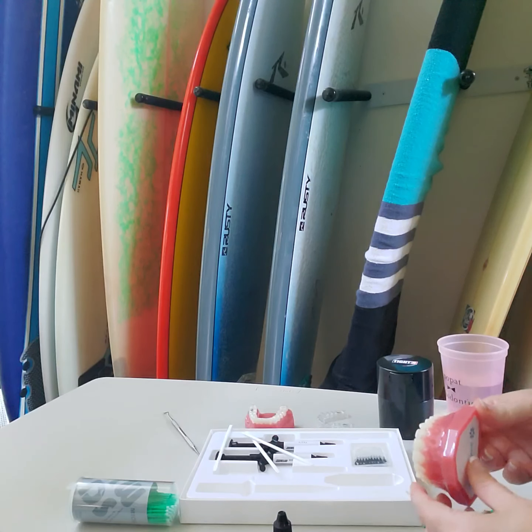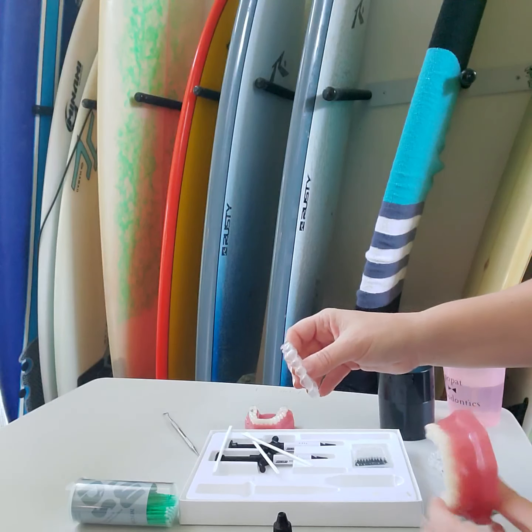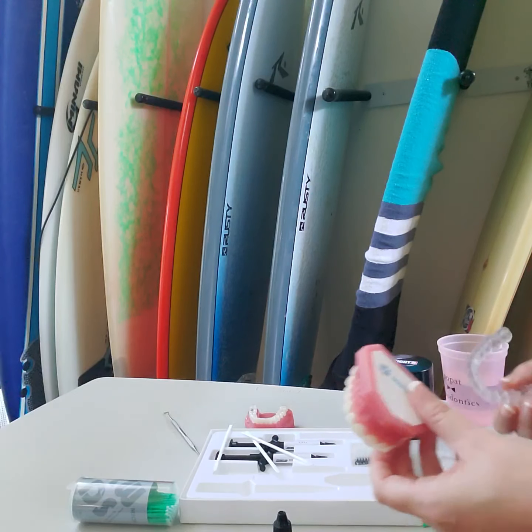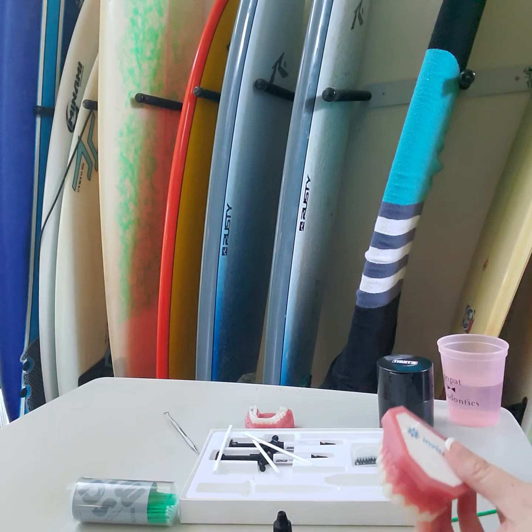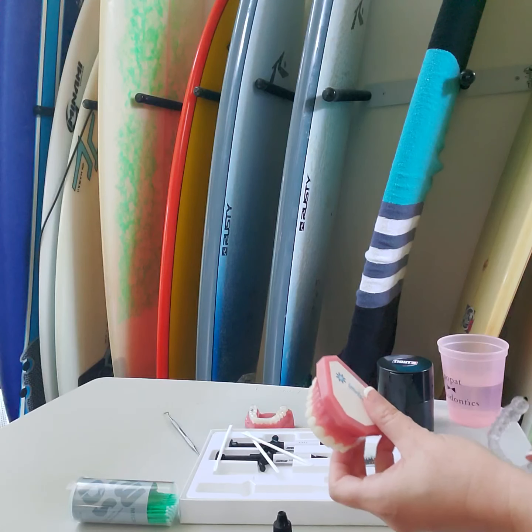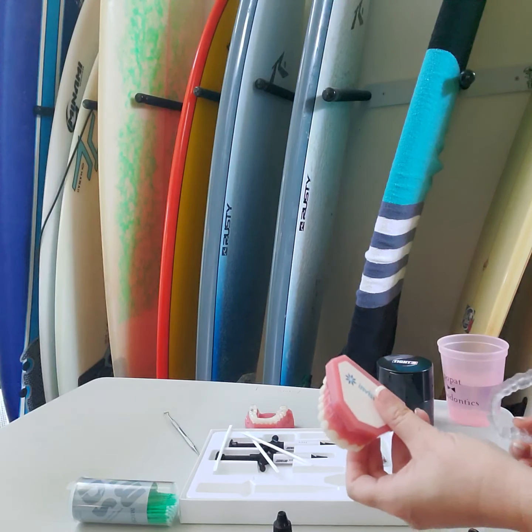Later, when the teeth are moving, save your attachment template because if teeth have moved, you can always section out a tooth and fix it if it comes off. Let the patients know how many attachments they have and tell them to count their attachments because theoretically they can knock one off if they eat something hard like a nut or a candy or something like that. And we need to get it put back on.